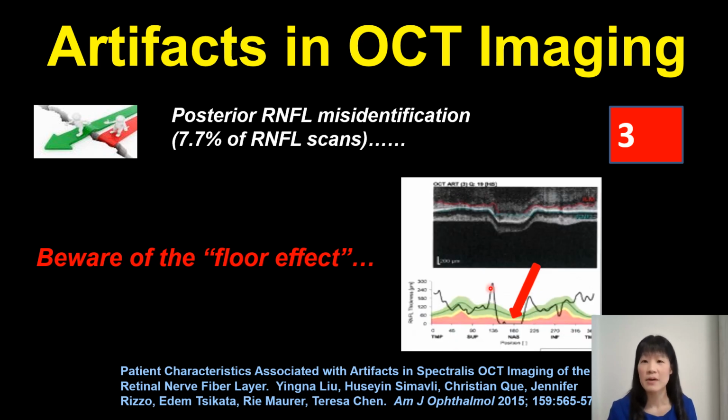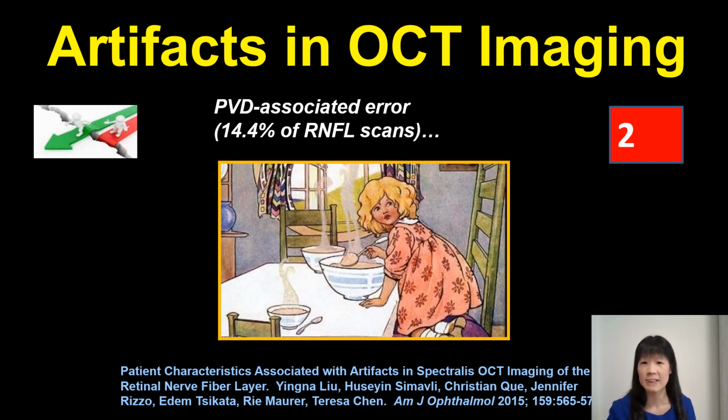Don't use that printout. Here you can see the scan is terrible. And really, you shouldn't look at this data because here the RNFL thickness is 0, which makes no sense because it should be at least 50 microns. So you know the data is bad.